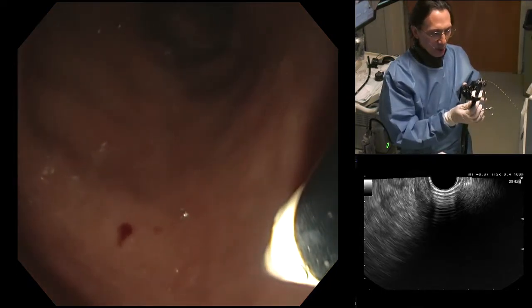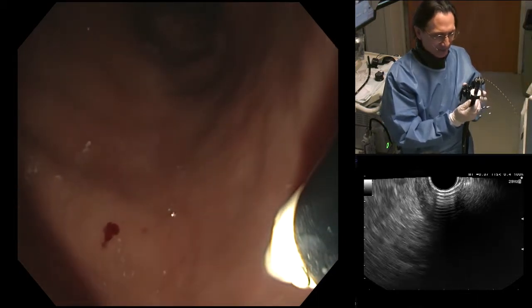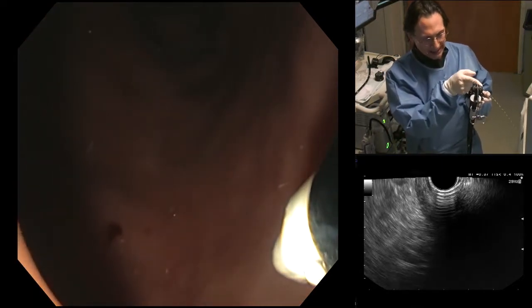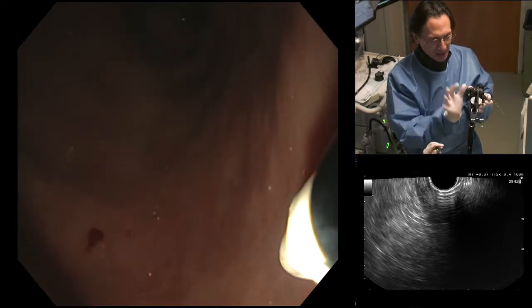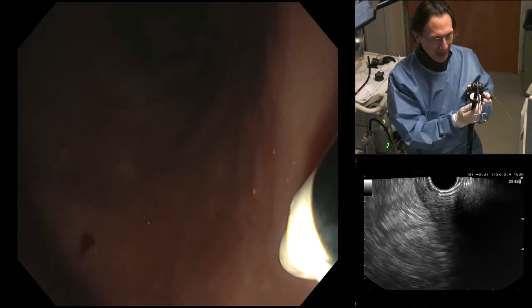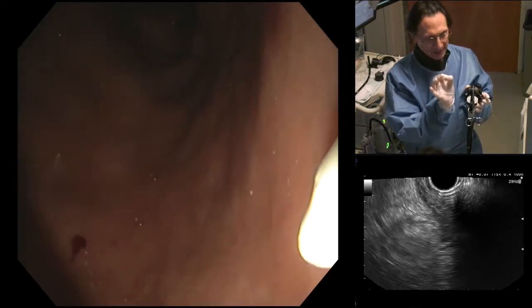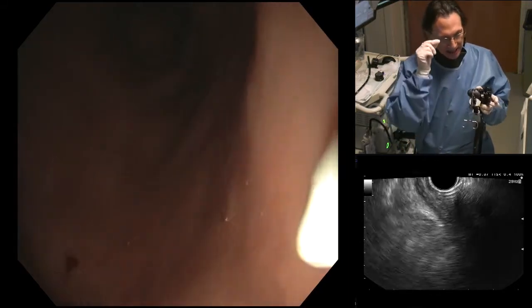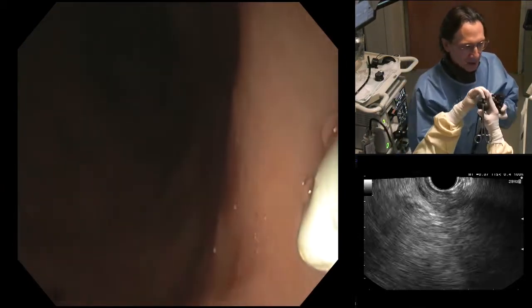So what you don't want to do now is pull this back. You can pull it back ever so slightly, but very carefully to make sure that you're not detaching. You see the black mark? You see the white ceramic? That's the ceramic portion of the bougie tip. You want to make sure those two always stay together. They cannot separate. As long as you pull back and they stay together, it's okay. You can see how this tapers very finely towards the tip. There's a micro wire at the very tip. That's what allows us to gain access with cautery so nicely with minimal coagulation effect.